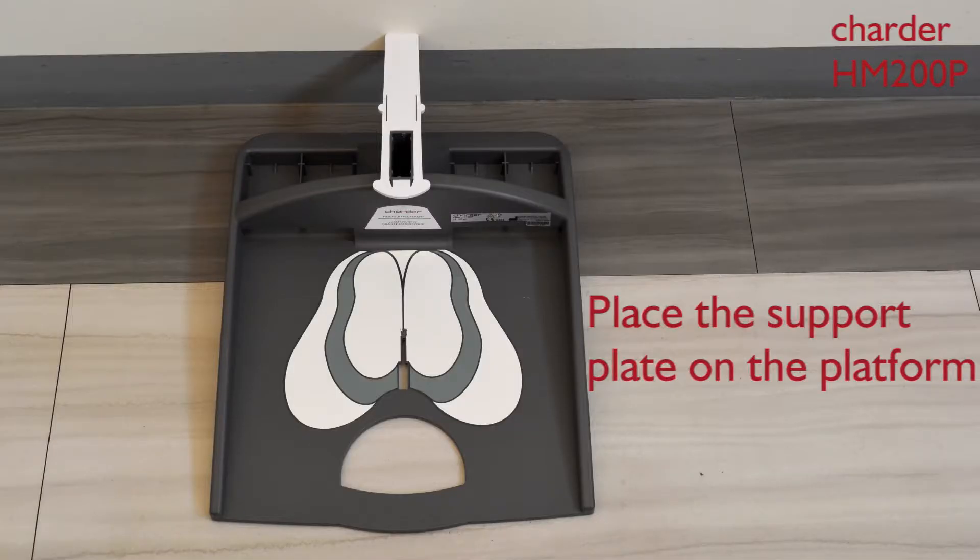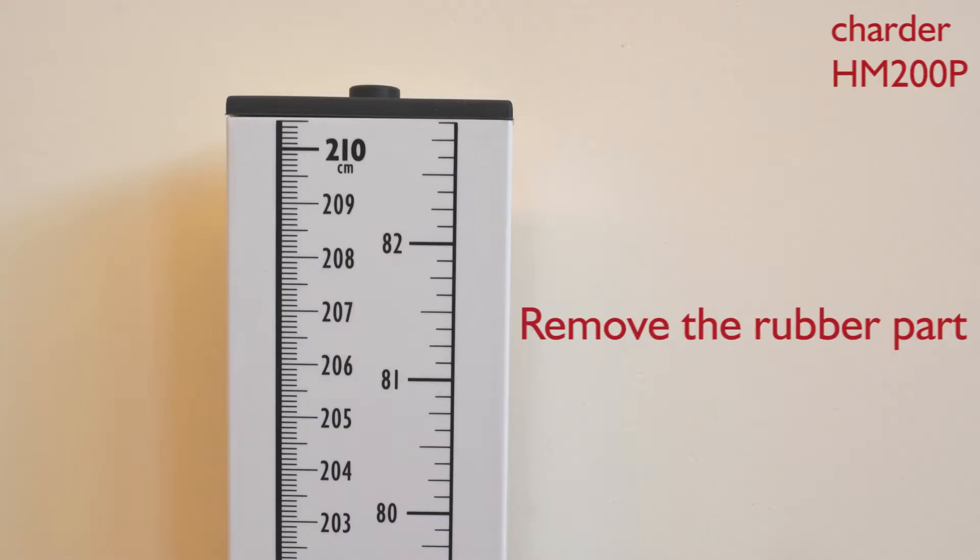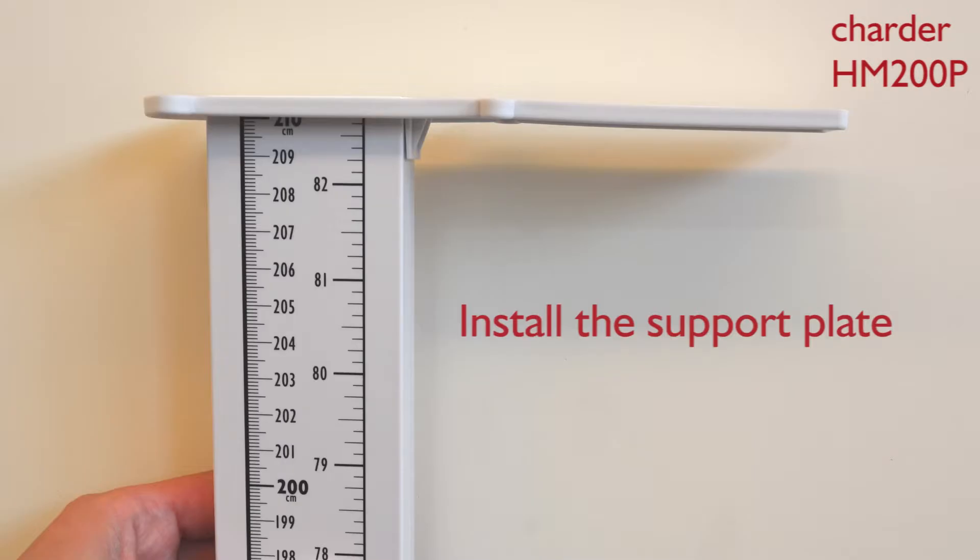Example assembly procedures. Take out the measuring rod which is showing 210 cm. Removing the rubber cover on the top.